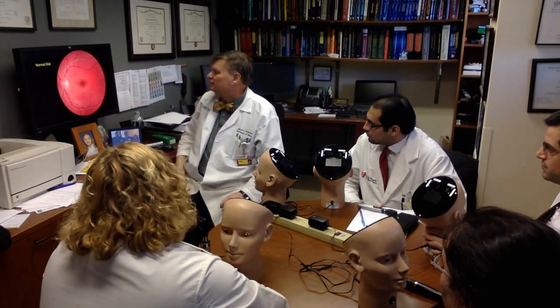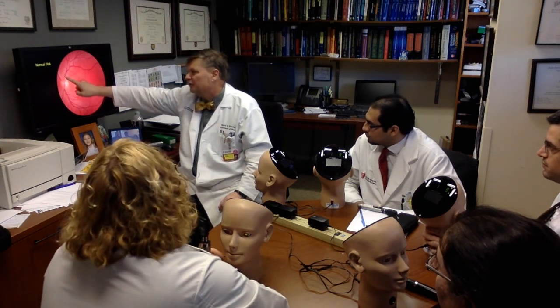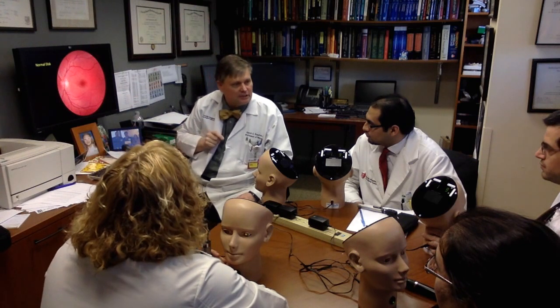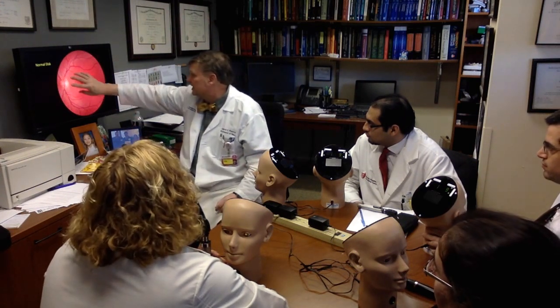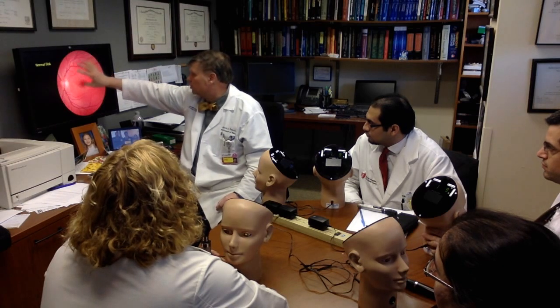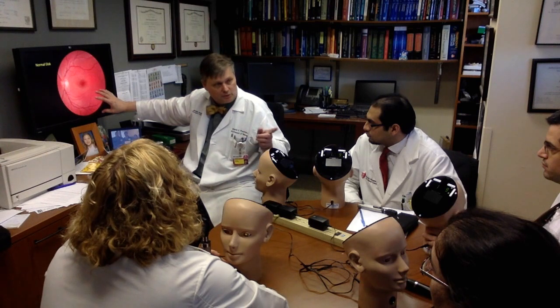temporal. You try to figure out, what's the artery, what's the vein? Right here, this is the artery, this is the vein. The artery is thinner, the vein is bigger, the vein is redder. You're going to try to get a view of the 4 quadrants of the retina if possible, looking for abnormalities that we'll look at in a second.